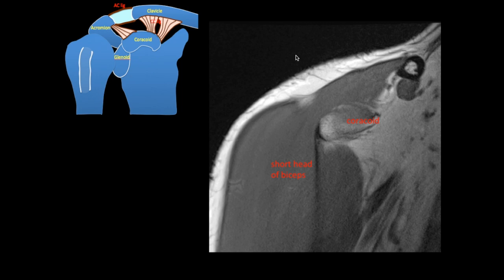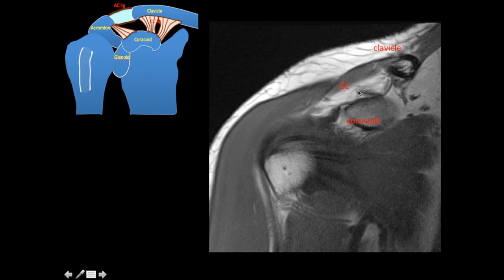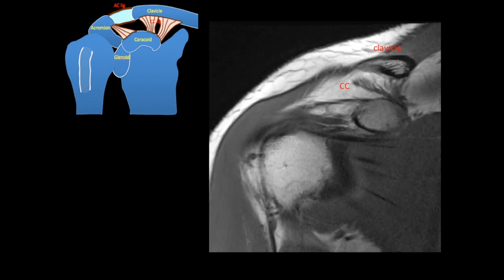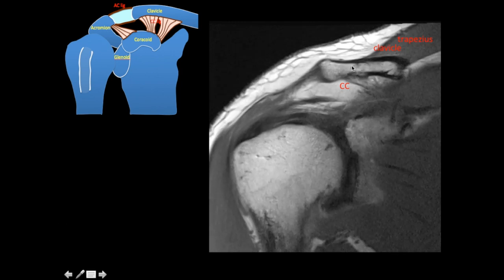On coronal MRI images going from anterior to posterior: the anterior-most image shows the coracoid process with the short head of biceps tendon attaching to it. Going posteriorly you see the clavicle with the trapezius attaching superiorly and the deltoid attaching inferiorly. Then a thin hypointense structure arises from the coracoid — this is the coracoclavicular ligament. Tracing it posteriorly you can see the two components: the medial conoid and the lateral trapezoid, with fat between them, and the ligament attaches to the undersurface of the clavicle.